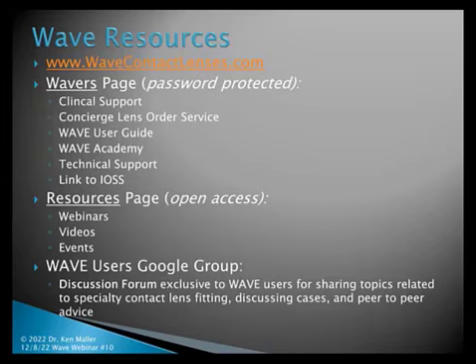You needed way more skill at the slit lamp because basically the process consisted of, I would take topographical data of the cornea, which now in retrospect, we certainly know doesn't indicate very much of what's going on in the sclera, which I had already figured out. What I would do is take the corneal data, design up a lens, extrapolate that out to the sclera in an RSIM fashion because I wanted to keep it simple. And then at the slit lamp, take a look and see all the things wrong with the flange. Areas where it's lifting up too high, areas where it's bearing down way too low, areas where it's much, much too tight, and it's causing vascular congestion, blanching of the conjunctiva, and the like.